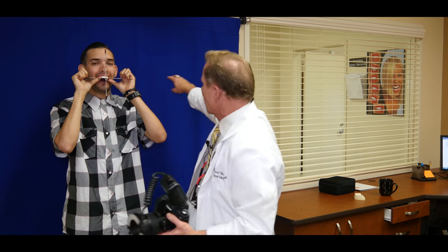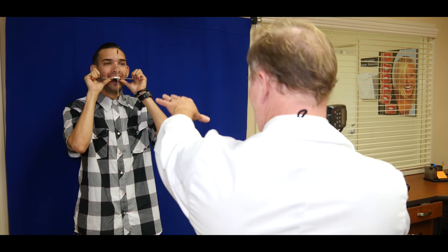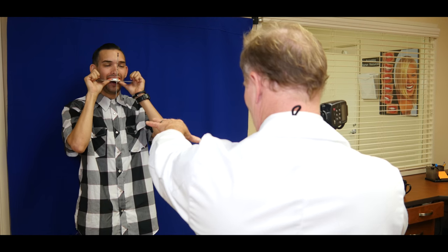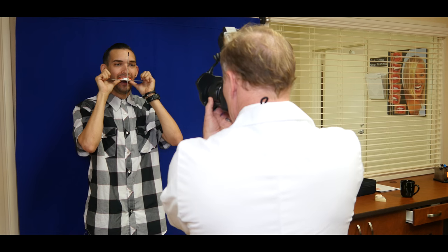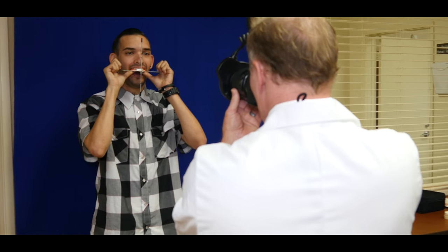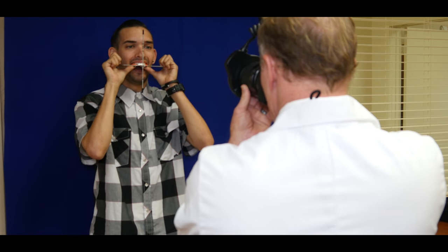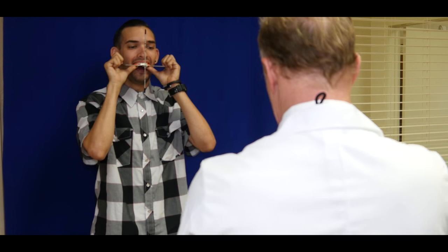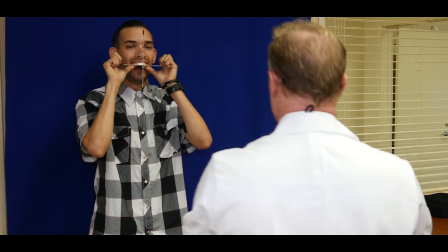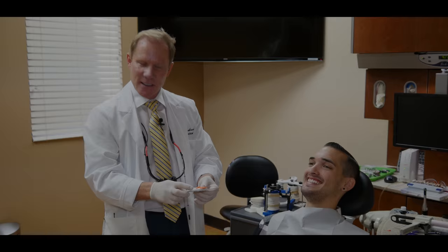So we're going to go ahead and move Jake. What I did is I just bought a blue background and put it up on the wall. We're going to have him stand parallel, chin down a little bit, and focus the camera. Again, my goal here is to get the horizontal and vertical axis of the plate. Look straight into the camera. Perfect. Great. You can go ahead and take that out, Jake. All right. Thanks.